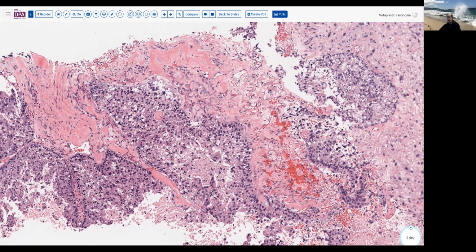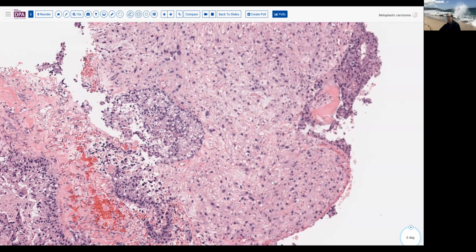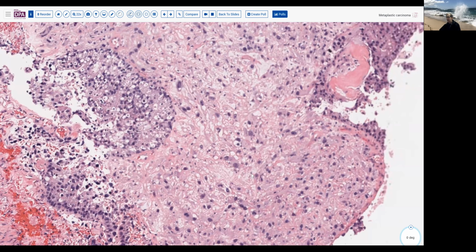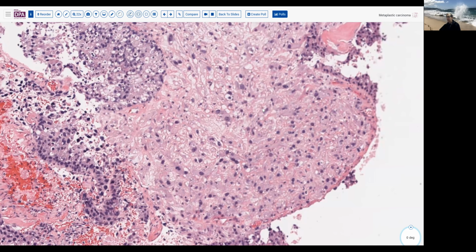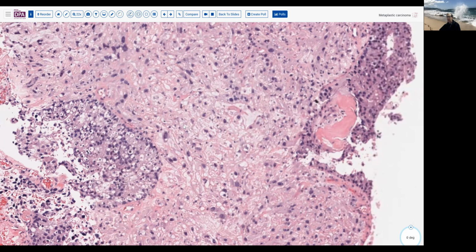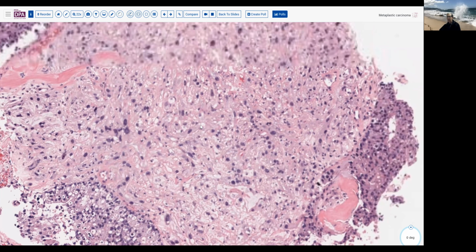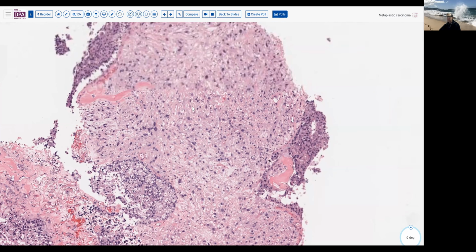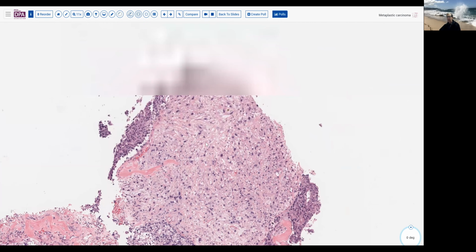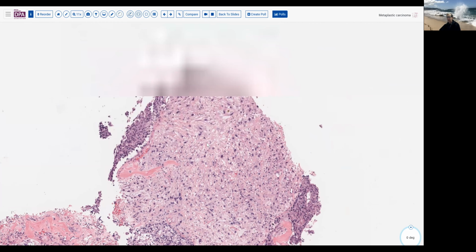High-grade tumor, and then we see this area over here with a clear, very mesenchymal-ish look, pleomorphic cells within this fibrinoid, slightly hyalinized, almost osteoid-like stroma. So if it looks kind of like a carcinosarcoma, you're probably dealing with what's better or currently termed metaplastic carcinoma in the WHO.